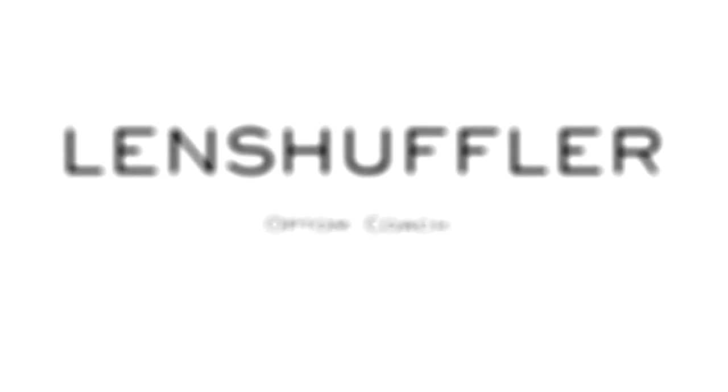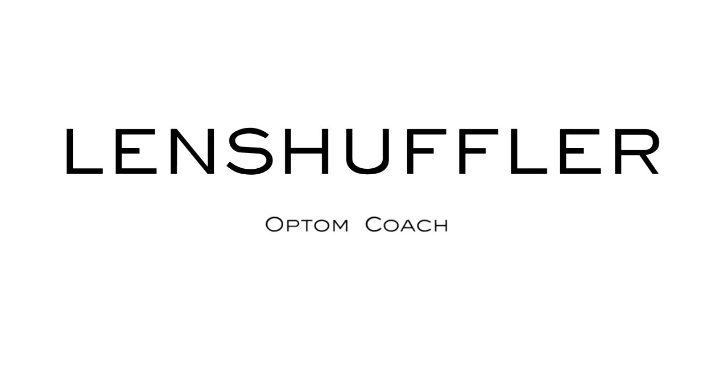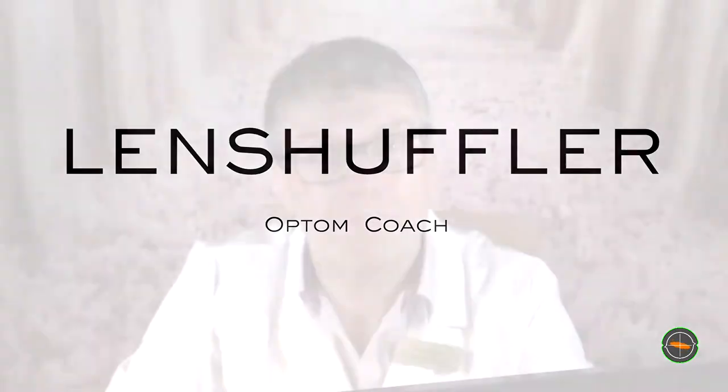We don't get a lot of chance to see other optometrists work. In this video you'll be able to. You'll see two great techniques in getting the correct cylinder power. Deciding on which cylinder power can sometimes be tricky. We're going to look at two great techniques from an experienced optom I filmed recently.